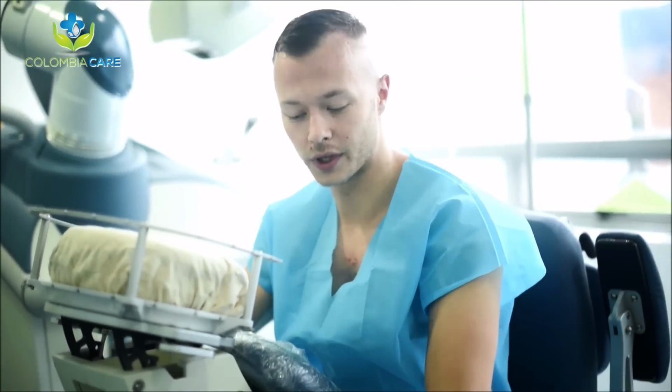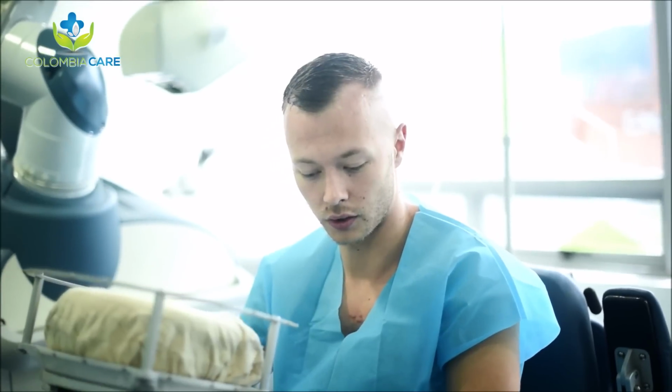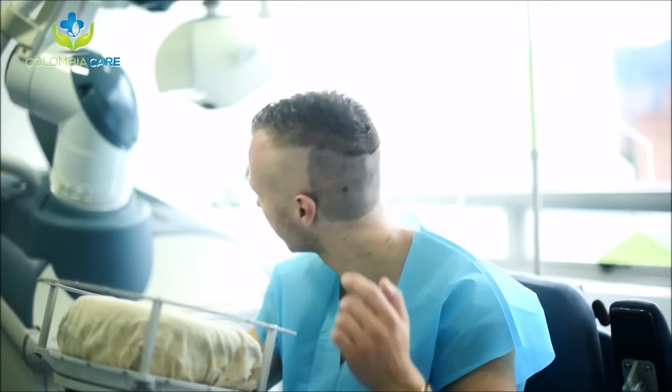Now, you can see on my face, I know it's getting real. It's time for ARTAS. So right now I'm on the ARTAS. What we're going to do is draw the hairline, see how it's going to find it, and then we're going to start extraction. The extraction procedure is like 3 to 4 hours. As you can see, they're painting the hairs in the back because I'm blonde, so the robot has a better idea of where to get the grafts.